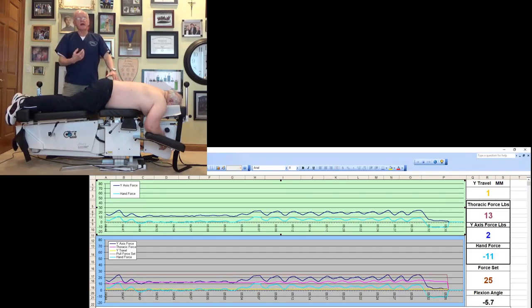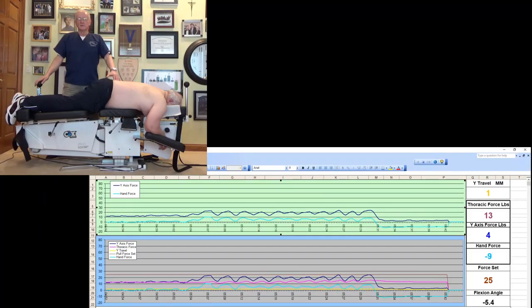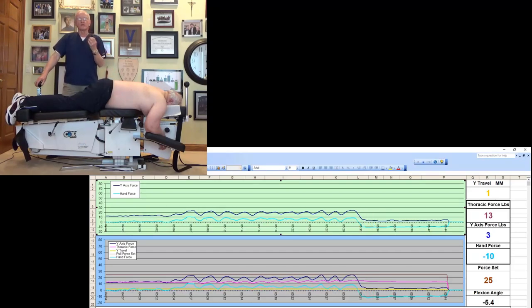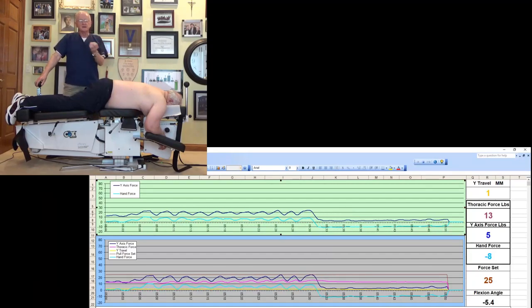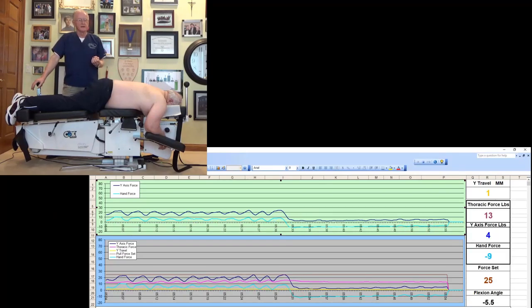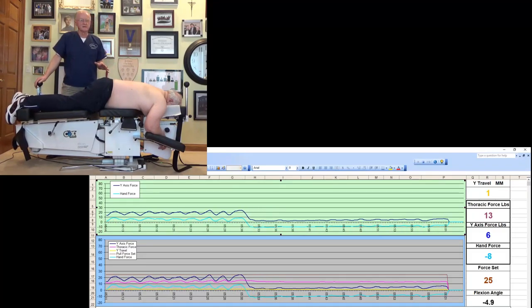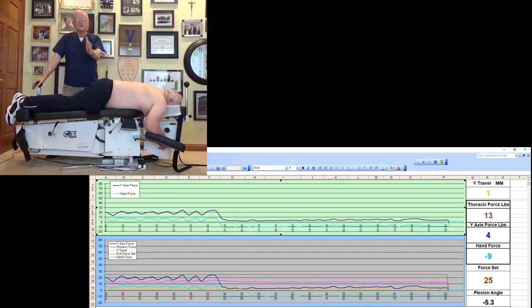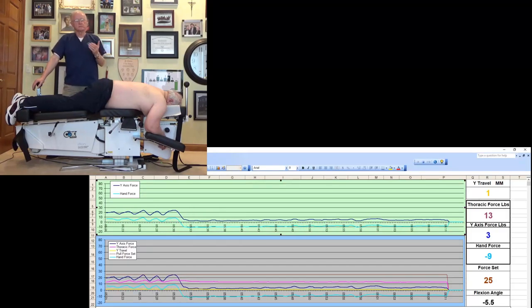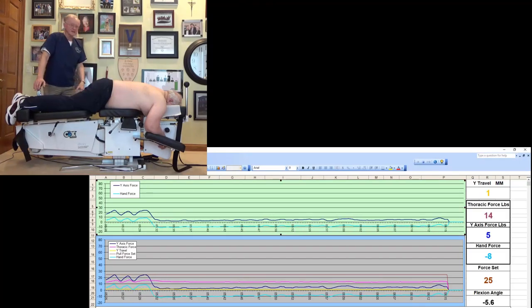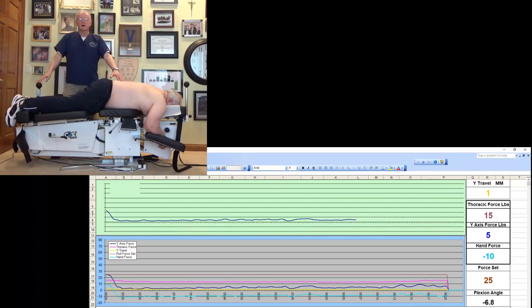I would like to take you from the manual application of this treatment to the automated distraction. Automated distraction is a much stronger force than is manual application. So we always begin treatment with a manual technique, which we just observed, so that we can tolerance test the patient. We can say, does this cause you any discomfort? And we can thereby adapt our force to the patient response. At the point at which a patient is 30 to 40% relieved, I will lock the instrument at the flexion angle of comfort to my patient and institute automated distraction.